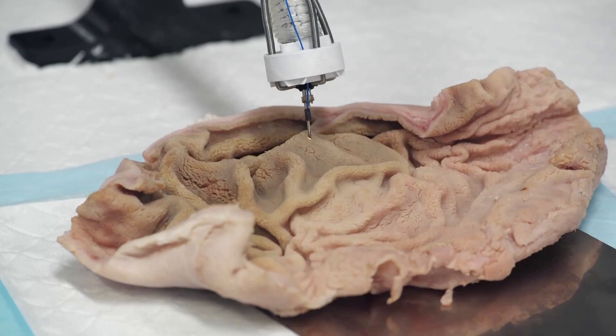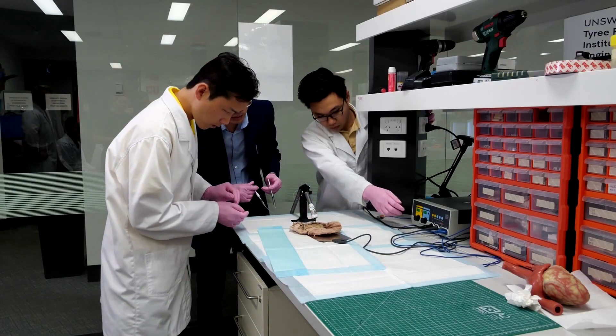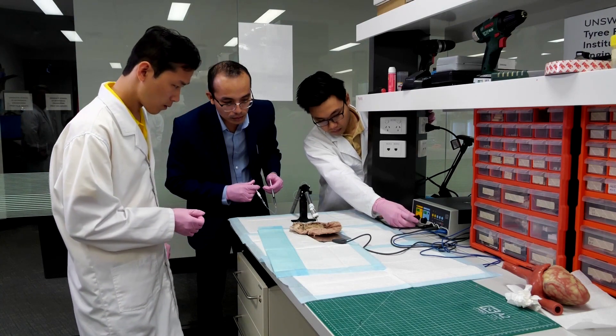Currently, bio-materials must be created outside of the body before relying on more typically invasive surgery to insert the materials inside. This can lead to high blood loss, infections and other complications.